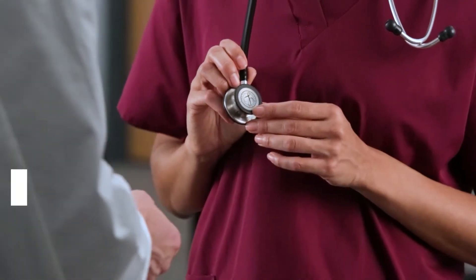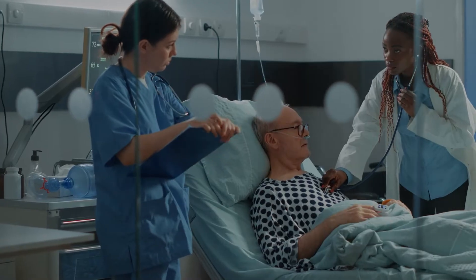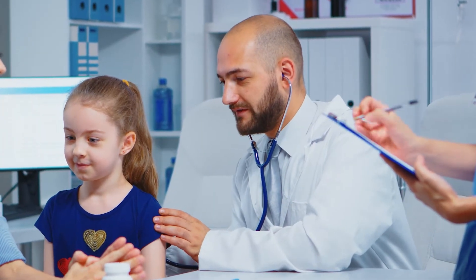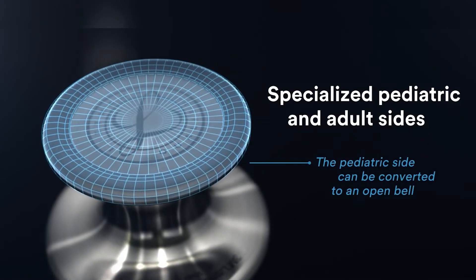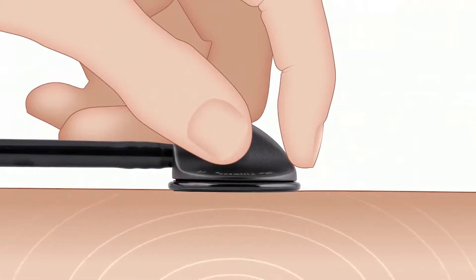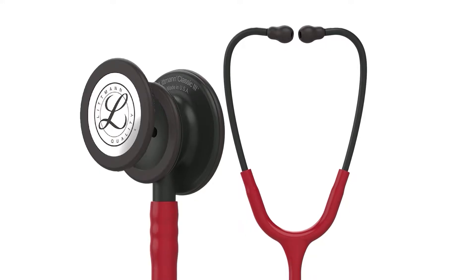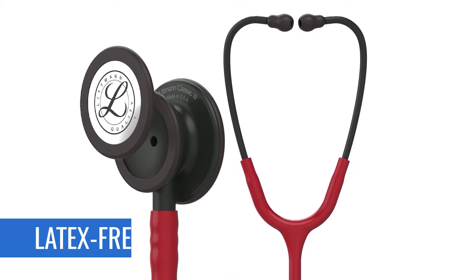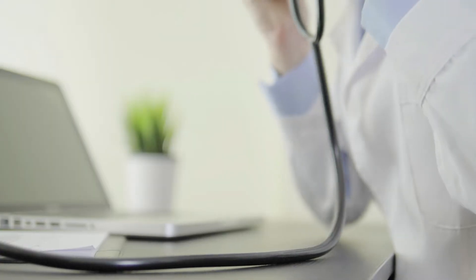The Littmann Classic III is designed with a dual-sided chestpiece made of stainless steel for both adult and paediatric assessments. You can even convert the paediatric chestpiece into a traditional open bell if you want better sound specificity. And just like most Littmann stethoscopes, you can easily change the frequency of sound by applying pressure on the tunable diaphragms. Every component of the stethoscope is free of latex, so you don't have to worry about your patient's allergies or any environmental hazard it may cause.